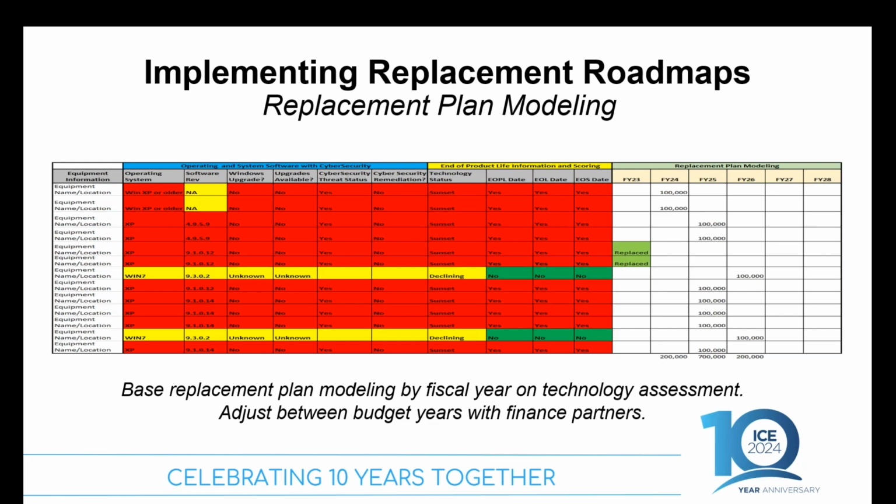What we did then is rank devices, and you can see we built that out there, and the spreadsheet's cut off, but I think what we did was we looked to grade. And because the life cycles in imaging are so long, at 15 to 17 years, we went out with 10 to 15 year planning cycles with imaging. Okay.